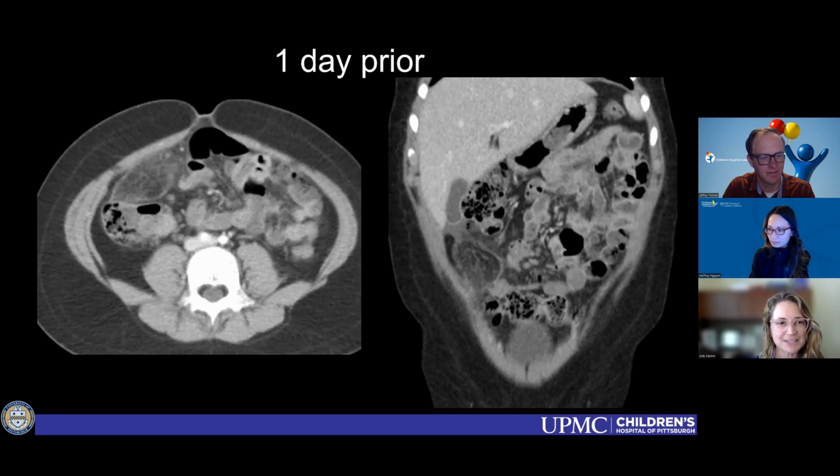But the reason I'm asking for your opinion on this case is, why did we do the ultrasound in the first place? Do you have any protocols at your facilities that if a patient has had a CT, you require that it be looked at before you will do an ultrasound? I'll tell you, I didn't even know there was an outside CT when I read our ultrasound. From a policy standpoint, have you been successful in reducing ultrasounds after a diagnostic quality study has already been done elsewhere?